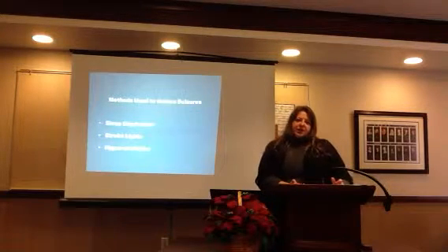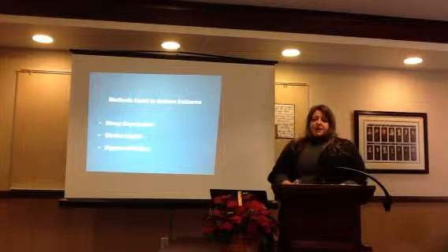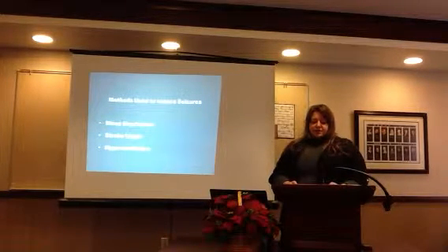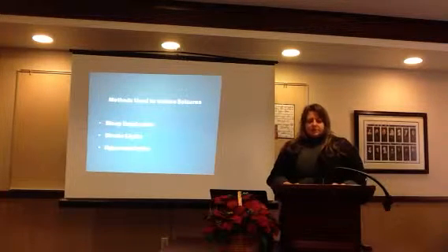I mentioned earlier sleep deprivation. This is the first method. The second method is photostimulation. This is done by putting a strobe light in front of the patient's eyes, and it helps to establish if the patient has photosensitive epilepsy. The third method is hyperventilation, by taking deep breaths in and out for 3 to 5 minutes. And in younger children, this is best accomplished by having them blow on a pinwheel.